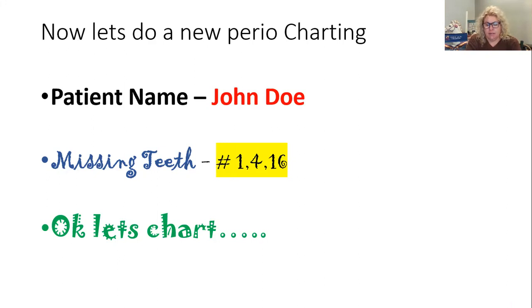Everybody should have said mesial lingual of 13. 3, 3, 2, 3, 3, 2, 3, 2, 2, 2, 2, 1, 2. Where am I? You should have said or thought to yourself, mesial lingual of number 8.